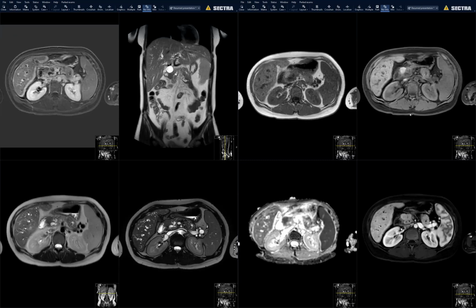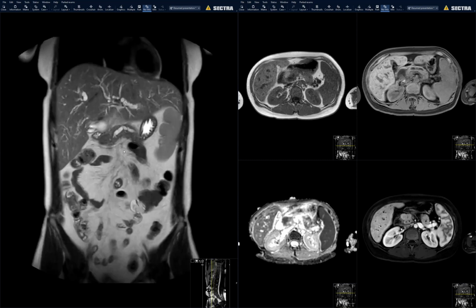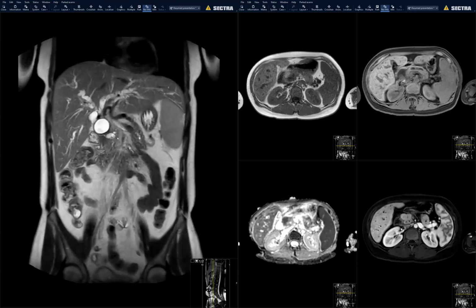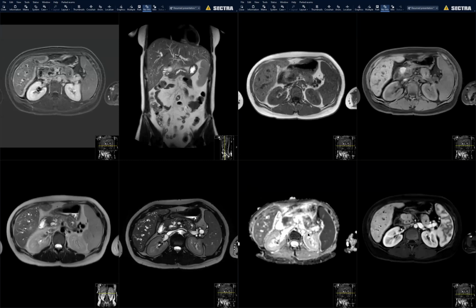Yeah. So this is a 31-year-old lady who has had a history of pancreatitis since she was 16. This is her T2. She's had an ERCP stent placed before, and she's back with elevated bilirubin. There was an outside study, which I don't have, which showed a dilated pancreatic duct and dilated CBD. They didn't see this for some reason, but there is a stone, sludge, something there. What's really interesting is that she has this hyperintense lesion in the region of the pancreatic head, and it restricts intensely on the ADC map. These are the post-contrast images, and there is minimal, if any, enhancement. This is subtraction, and these are T2-weighted.